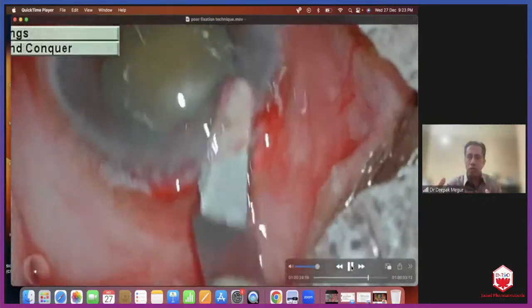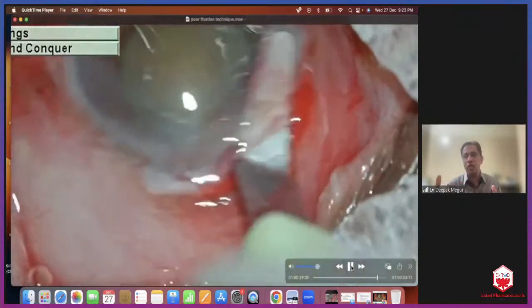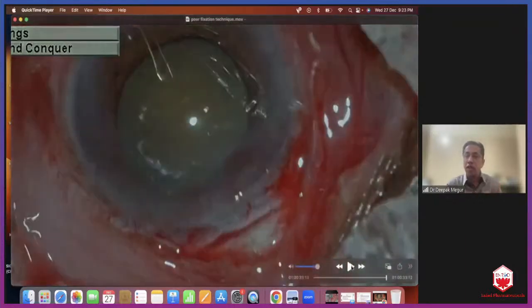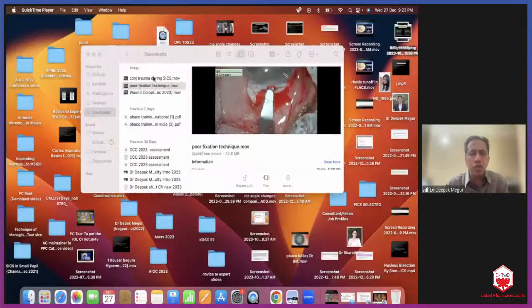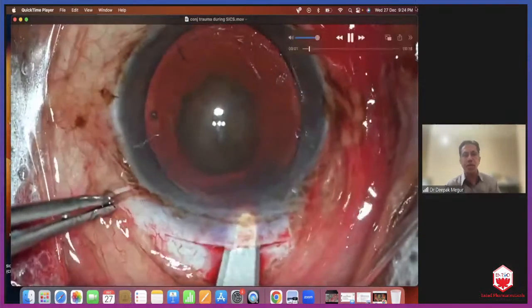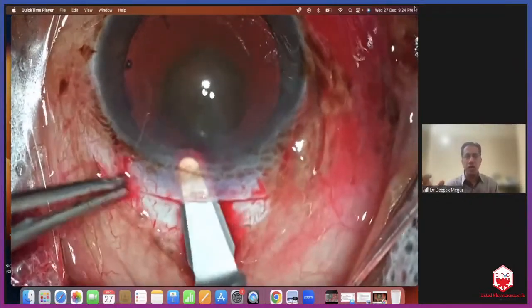You have to have a good pair of forceps. When you're doing this tunneling, you cannot have the globe moving like this. The plane at which you cut is going to be in a different plane altogether. And most often, the amount of conjunctival trauma you induce with the way you stabilize is also quite significant. So we need to teach the basic things, like just respecting the tissue.